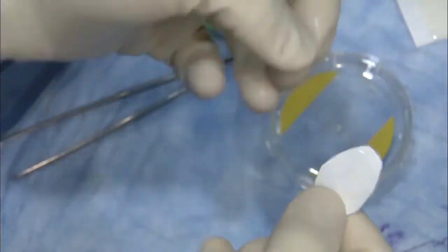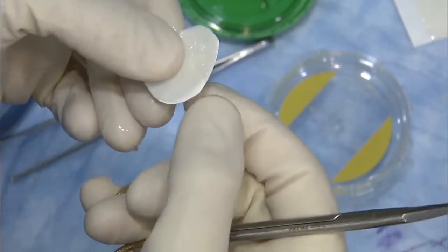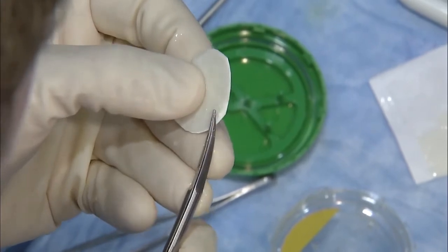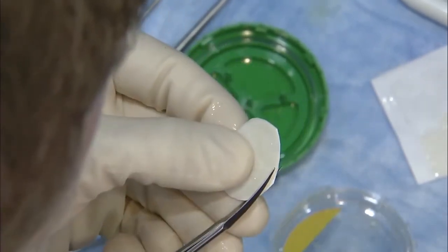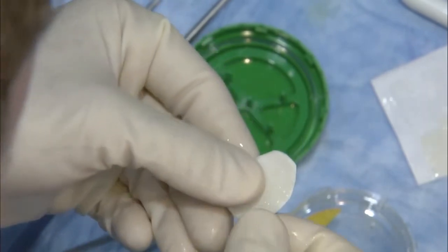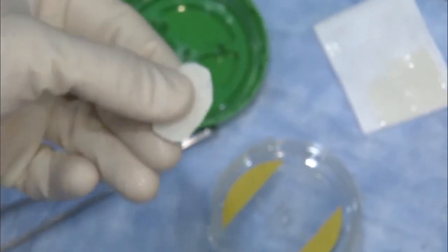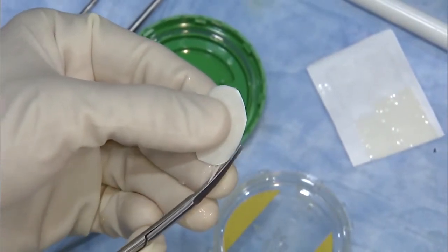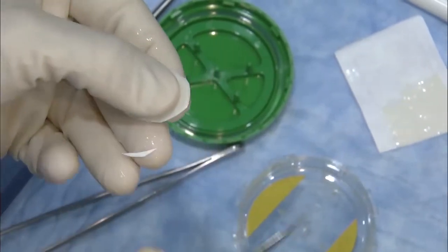So, to me that looks pretty good. Yeah, that's great. I'm trying to see my foil outline here. It looks a little wide over here. Again, really sharp instruments are helpful because it can be a little trickier than you think. It wants to slide around a little bit. Yeah, I keep a cartilage special pan with sharp Jones scissors.